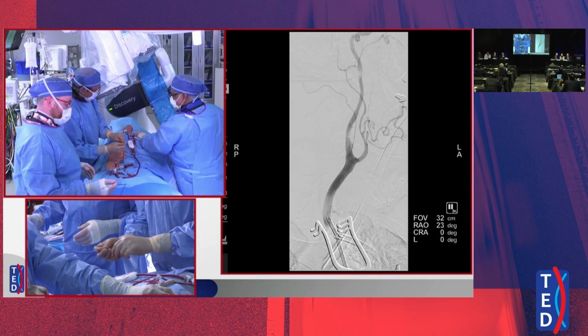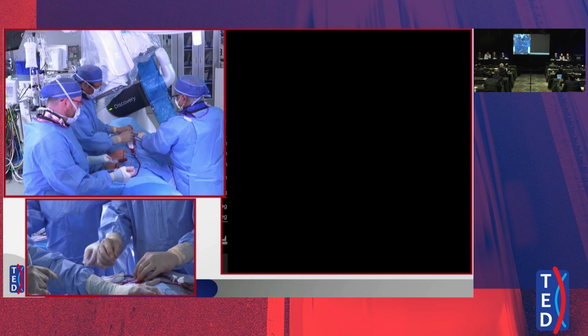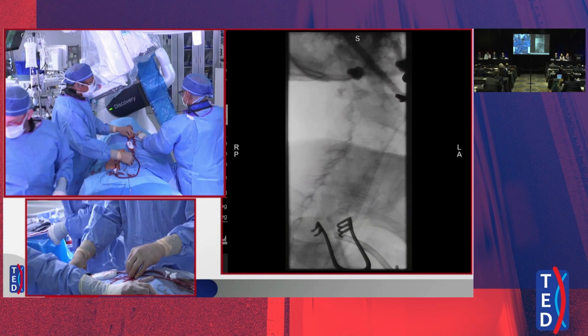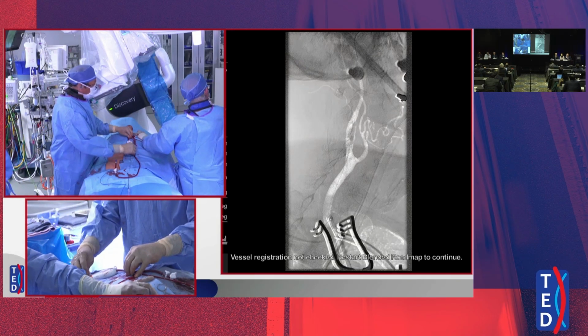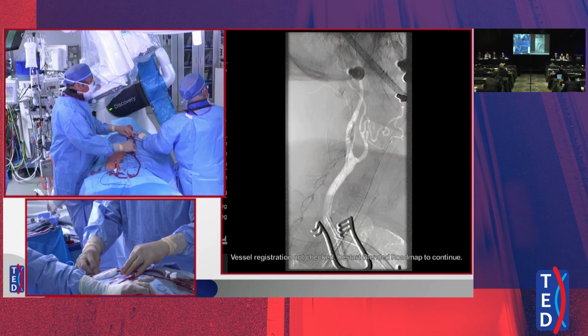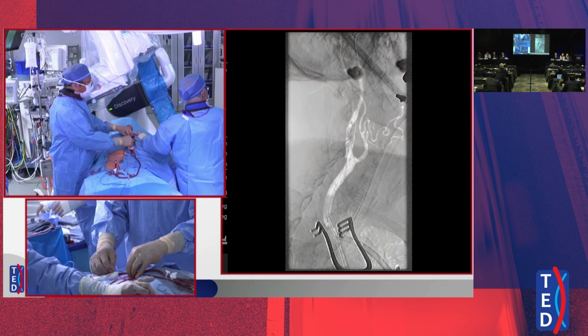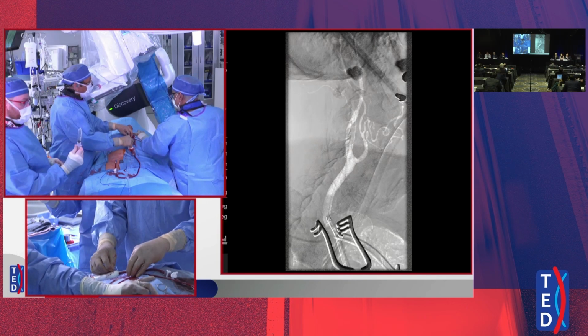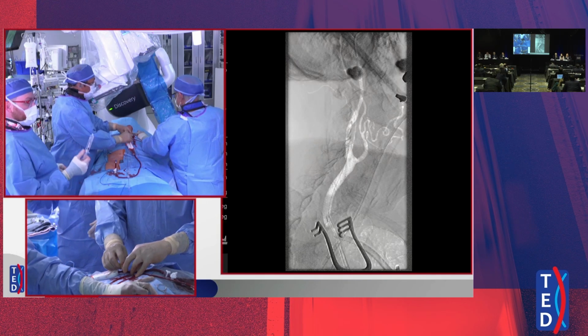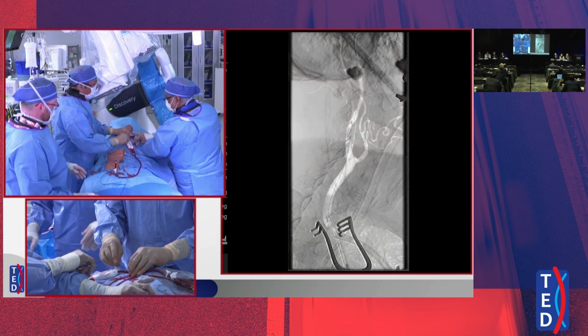Venki, what's the logic of doing a post-angioplasty angiogram? What does that help you with? Well, whether I dissected the carotid with the balloon, I know that. Do I have to extend the stent? I think it gives me a good picture. Once you get the flow back into the internal, it fills up pretty nicely, and you may even change your stent size or things like that.